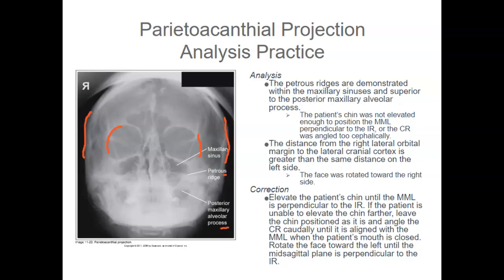It could be an angulation issue with the central ray if you were performing this AP and you had to do it supine for some reason, but typically if you're doing a sinus projection, you should have the patient in an upright position so that you can adequately demonstrate air fluid levels.